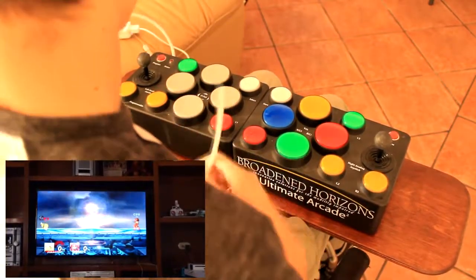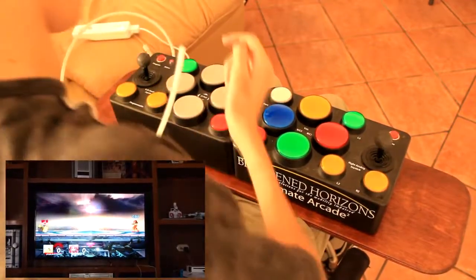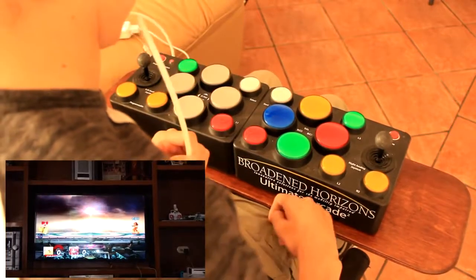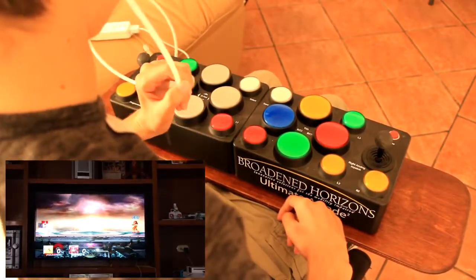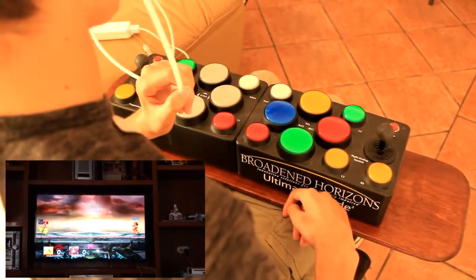I'll also do the same thing for the shielding. So I press program, then I press R1, and then I sip on it. So now I can put my shield on with siping and jump with blowing.